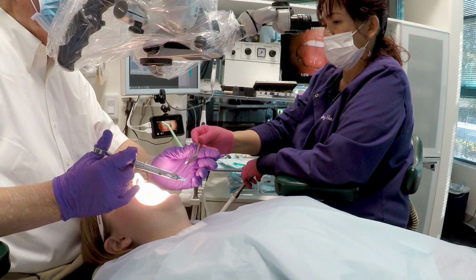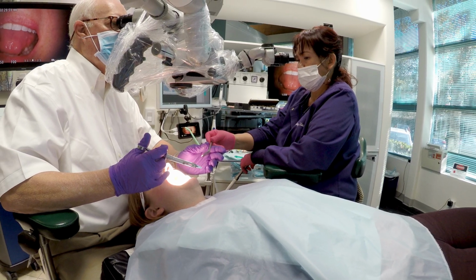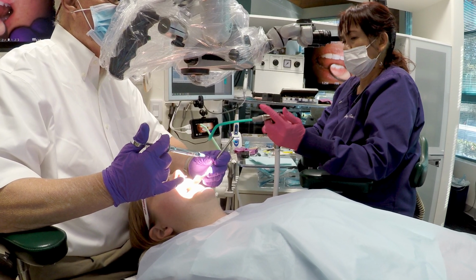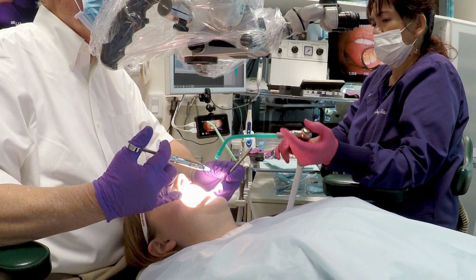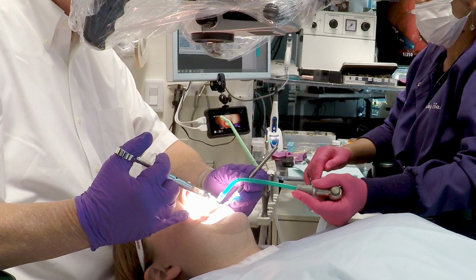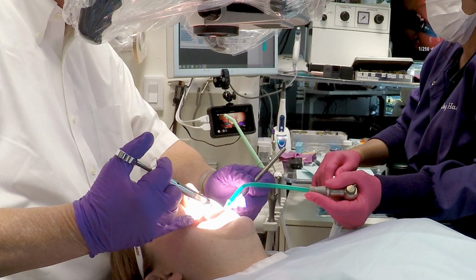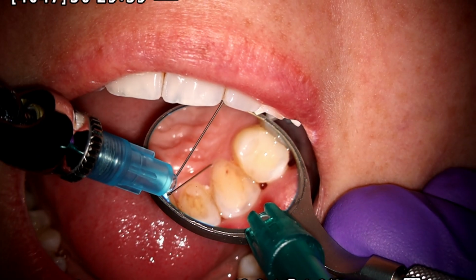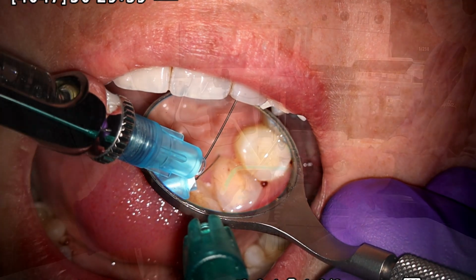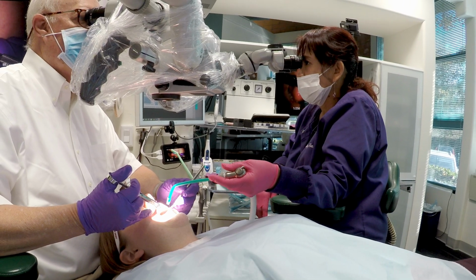She's right there, ready to defog the mirror as soon as I place the needle against the lingual tissue there. And she's right there with the suction. So to be able to do this seamlessly without other problems and being able to do it very accurately, you can learn this by showing these various angles. See, her suction is right by the mirror there. And I'm able to do this very, very efficiently.